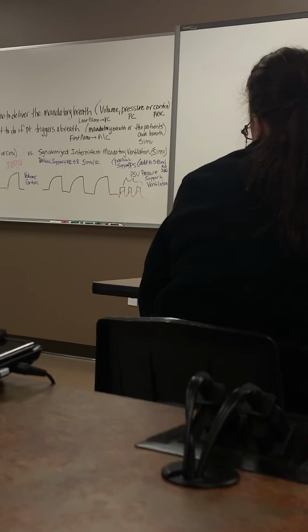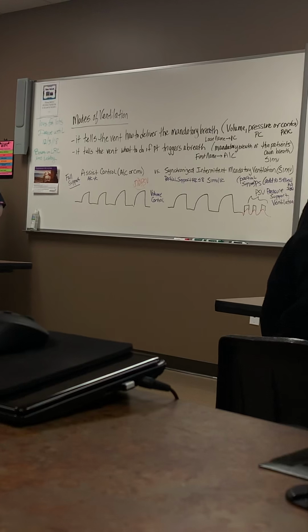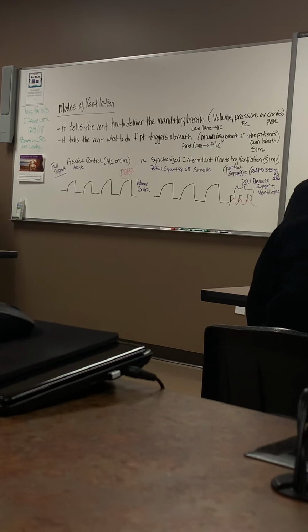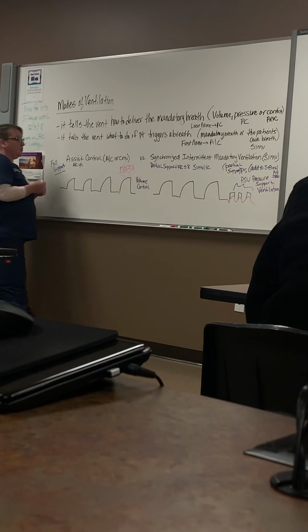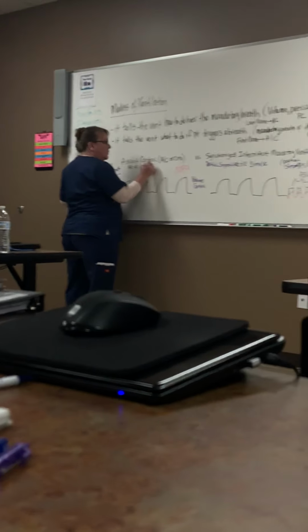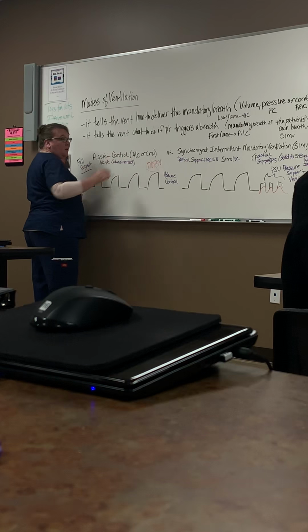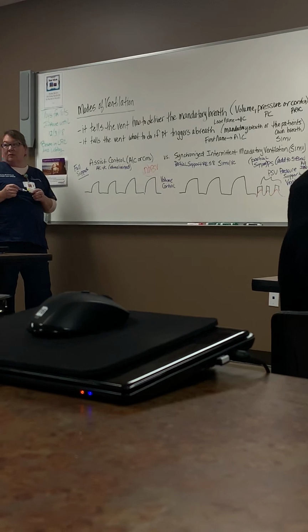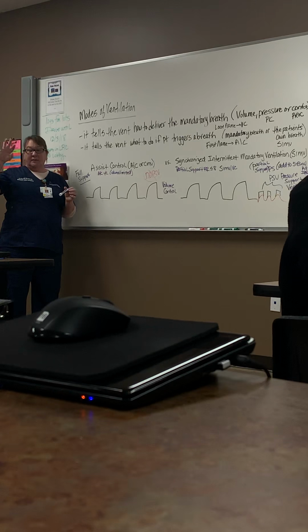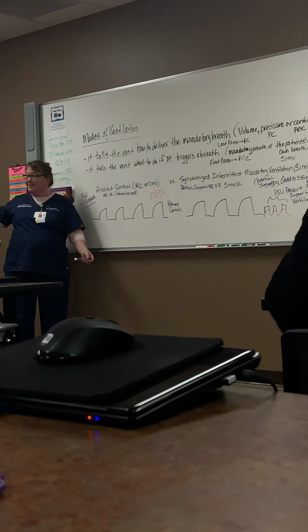So in a volume mode, remember volume control? Anybody know what other name it could be called from when we talked about the phases of a breath? Volume limited, yep. So this also could be called volume limited. Same thing over there. Volume control is also called volume limited. Remember, that's where I was like, you hear all these words that make no sense, and then you hear volume limited, and you're like, oh, that's volume control. I got this.